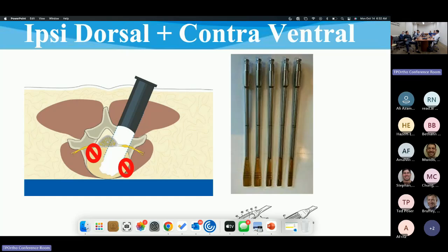When you're starting to do that though, the natural tendency is to have this kind of normal corridor where you're ipsilateral and superficial and contralateral and deep, and that's what the tube is showing you. And so that's where you do your discectomy, but you're neglecting the ipsilateral deep and contralateral superior areas of the disc. And so that's why you'll see some of these reports for when people do TLIFs, they remove like a third of the disc or something like that. You can do a lot more. You just got to be thoughtful about it and thoughtful about where your blind spots are.